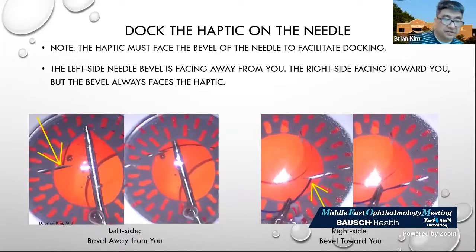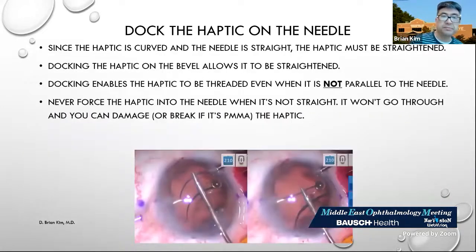So you can see again, on the left side the bevel is away from you, and on the right side the bevel is towards you. But you can see the approach of the haptic is almost perpendicular, but as you're able to flatten it, it engages the bevel and docks, and you're able to turn the haptic, flatten it out, make it parallel to the needle, and then you can slide it.